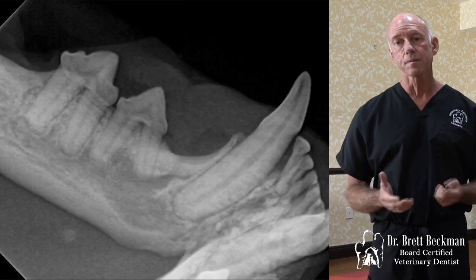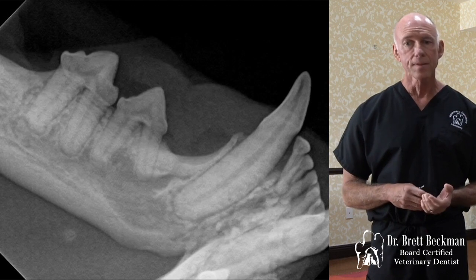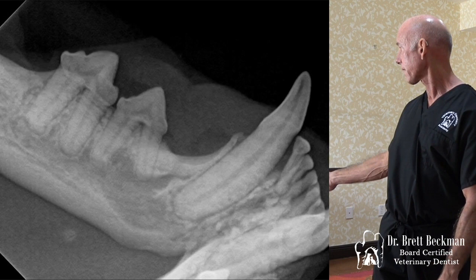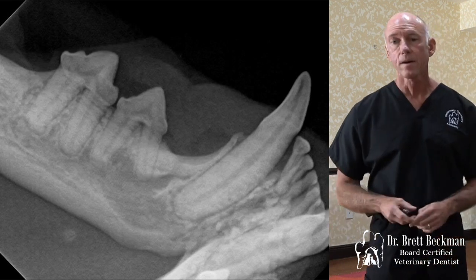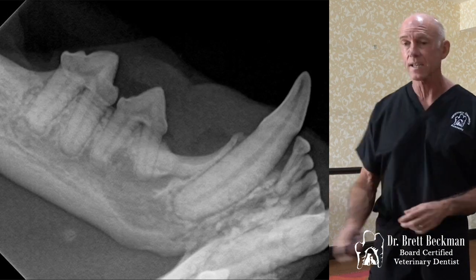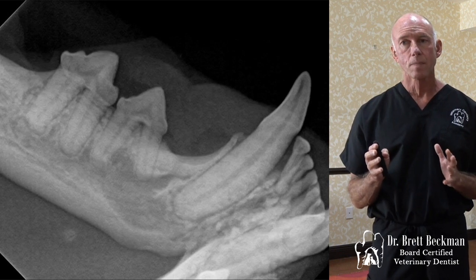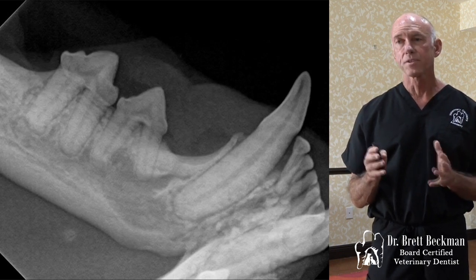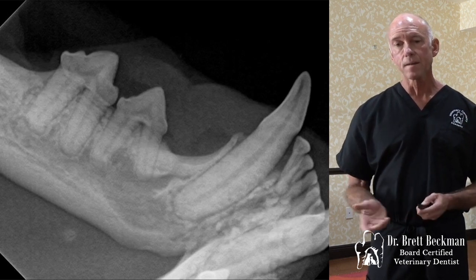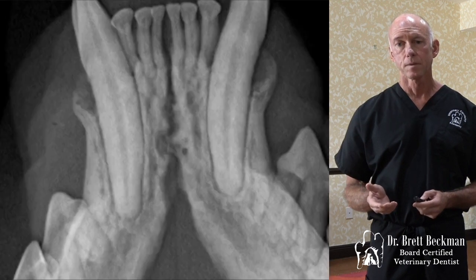On the other hand, we do have some patients that have it when it first starts happening, and this is one of those. If you look there on that mesial aspect and a little bit on this side, on the distal aspect first, and then the mesial aspect here by the incisor, you've got a little bit of pulling away of that bone from where it should be adjacent to that tooth. And if you find them at that level, a lot of times we can treat those.